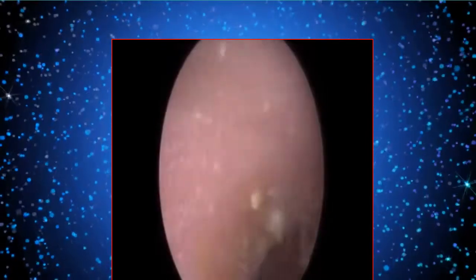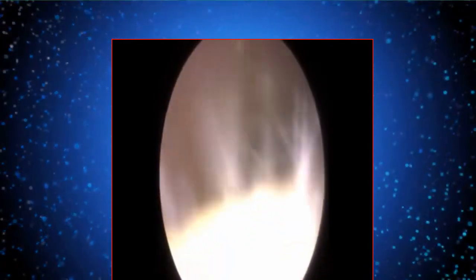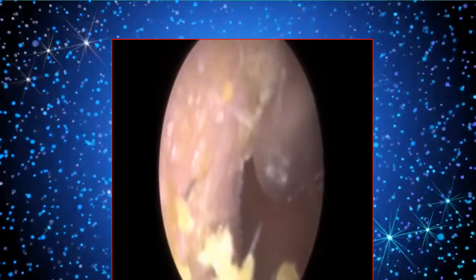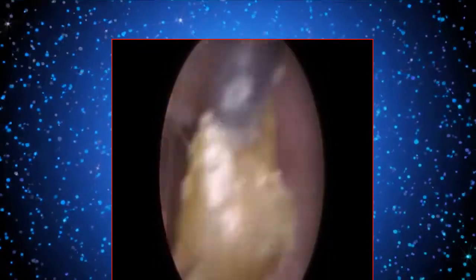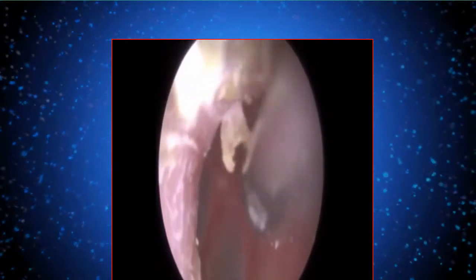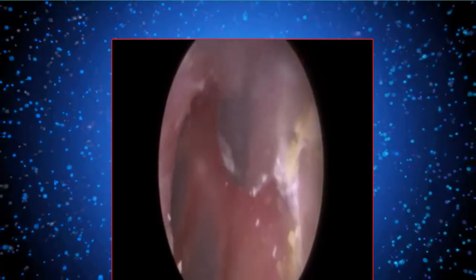We're on the right side now, so I'm just using an ear hook. It got a bit blurry there as I pulled the wax out — it smudged against the screen — but you can see the piece of wax that I removed. The tympanic membrane, the eardrum, is fully visible. There's just some dry wax. There's a little pimple there at the top of the screen — a little furuncle. We don't pop these; these are fine. It's quite common with people with otitis externa. There's no blood in there — it's not blood-filled. The patient has been rubbing his ear quite a lot because of the itchiness using his fingers, so that could have aggravated that little pimple. That will settle down; it's not painful for the patient. You'll see in a moment I was touching it with the suction probe.